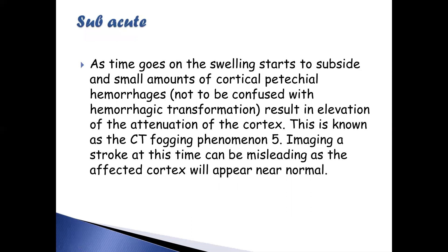As time goes on, the swelling starts to subside, and small amounts of cortical petechial hemorrhages — which should not be confused with hemorrhagic transformation — result in elevation of the attenuation of the cortex. This is called the CT fogging phenomenon. Since hemorrhage appears hyperdense (lighter), this can be confused with hemorrhagic transformation. If you image a stroke at this time it can be misleading, as it may look like hemorrhagic stroke when it was actually ischemic.